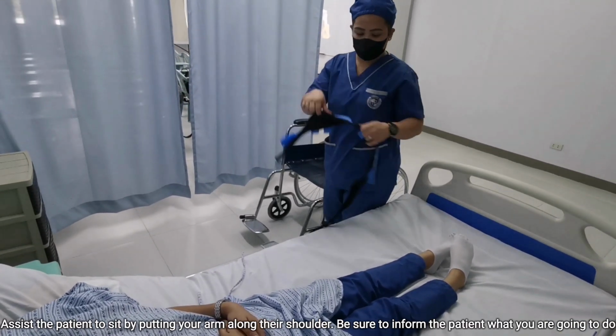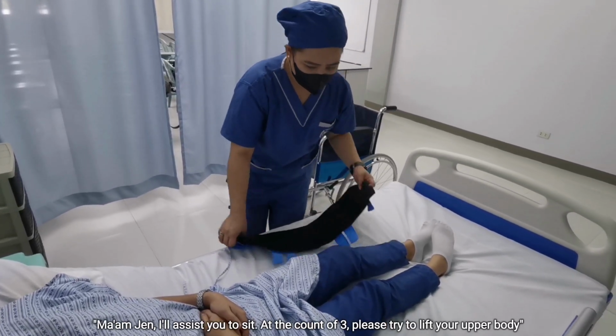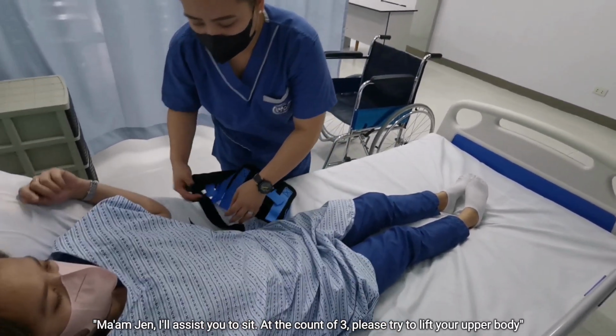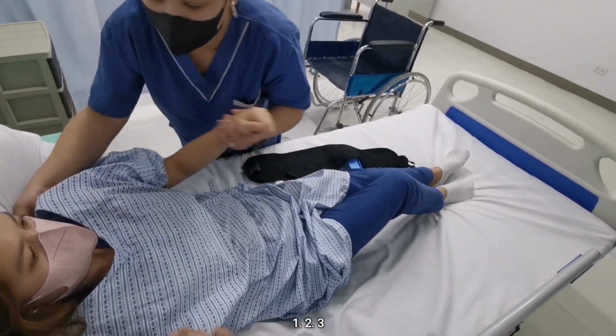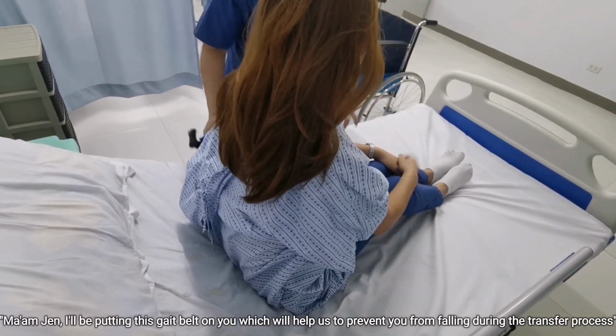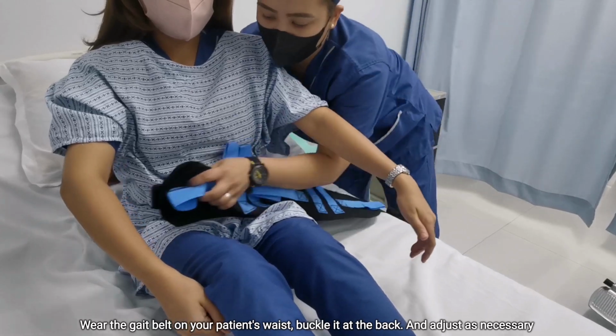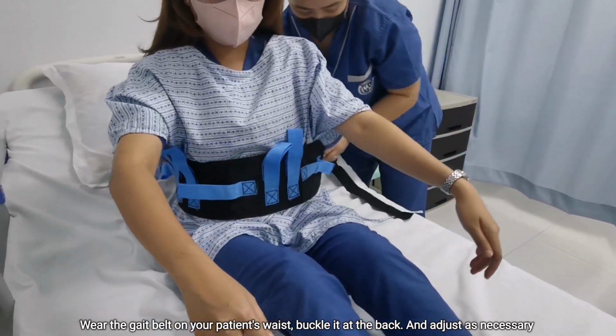Assist the patient to sit by putting your arm along their shoulder. Be sure to inform the patient what you are going to do. Ma'am Jen, I'll assist you to sit. At the count of 3, please try to lift your upper body. 1, 2, 3. Ma'am Jen, I'll be putting this gait belt on you, which will help us to prevent you from falling during the transfer process. Wear the gait belt on your patient's waist, buckle it at the back, and adjust as necessary.